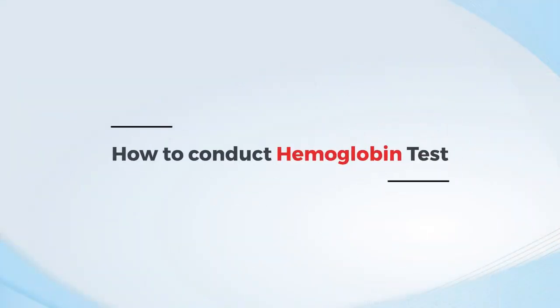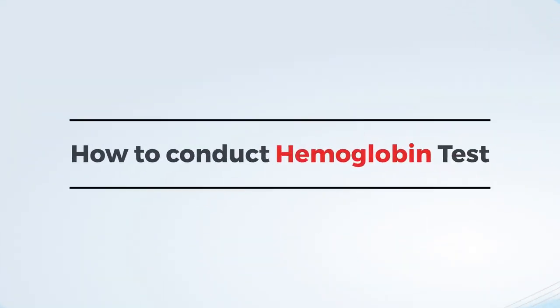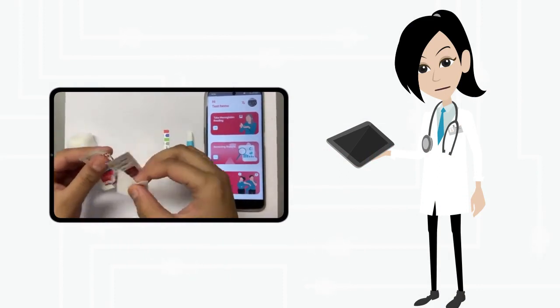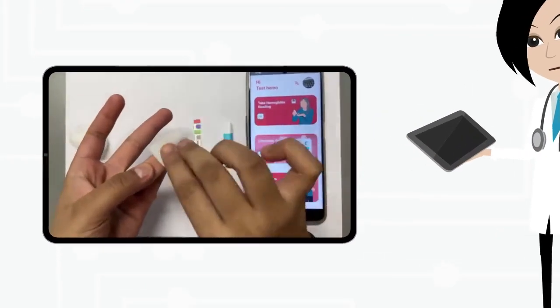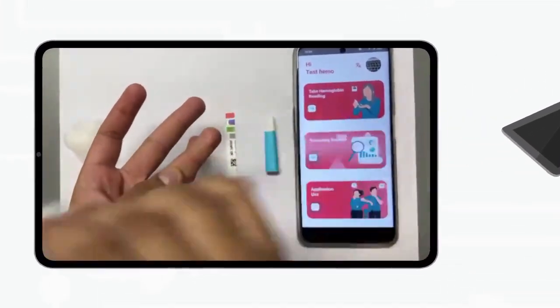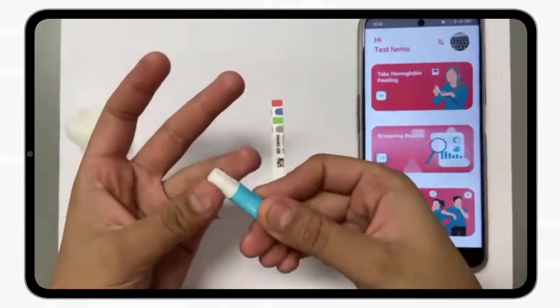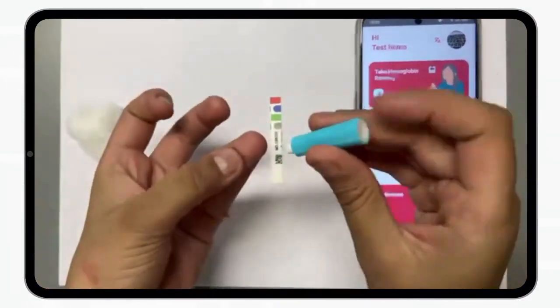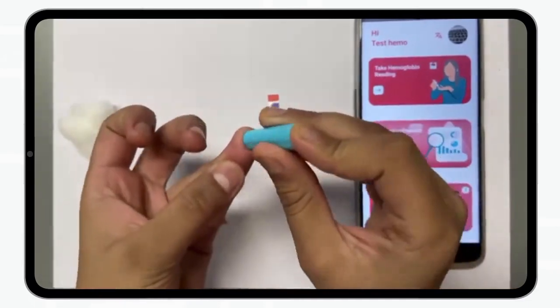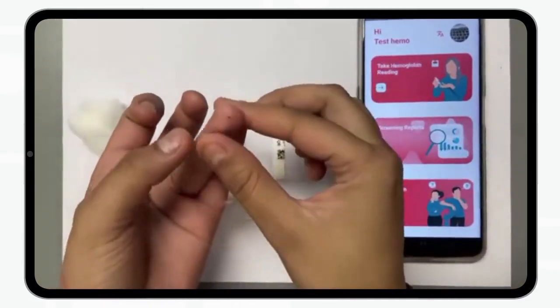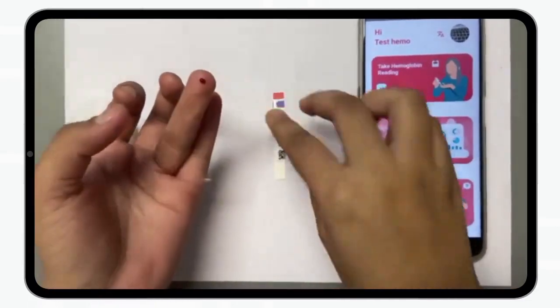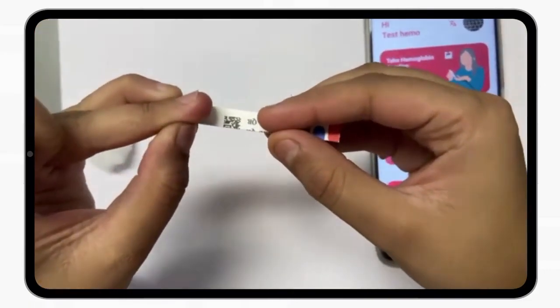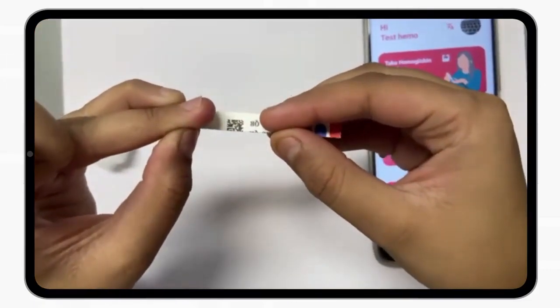Let's conduct a hemoglobin test. Prick the finger with a lancet for a blood sample. Transfer the sample to the test strip by adding a blood drop to completely fill the reaction pad.